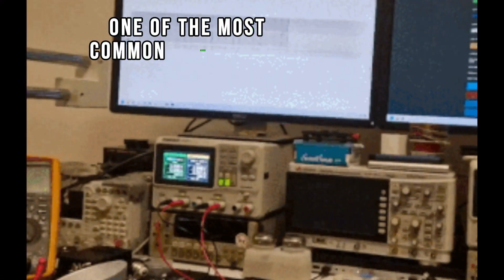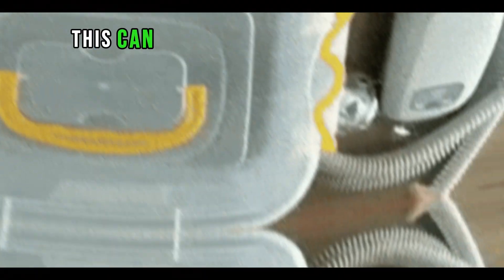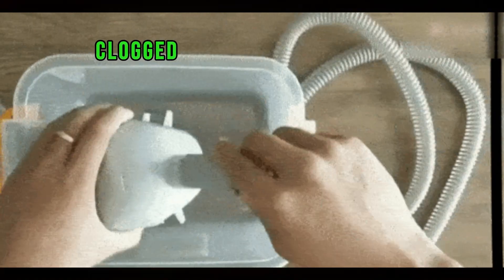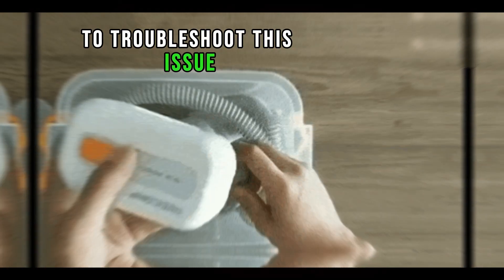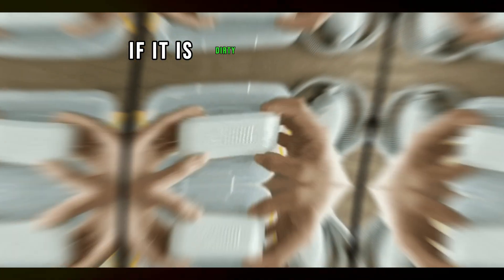One of the most common issues with CPAP and BiPAP machines is a lack of air pressure. This can be caused by a variety of factors, including a dirty air filter, clogged air tubing, or a malfunctioning machine. To troubleshoot this issue, start by checking the air filter and replacing it if it is dirty.